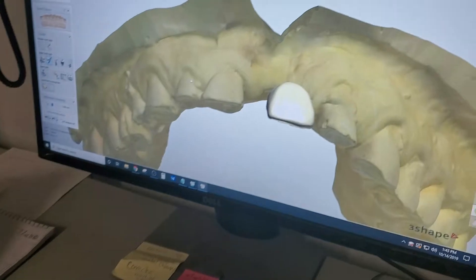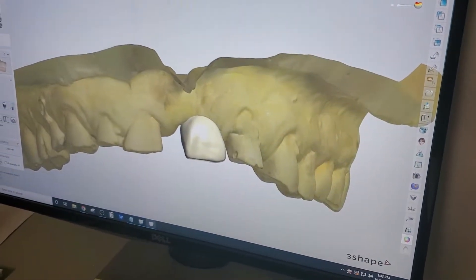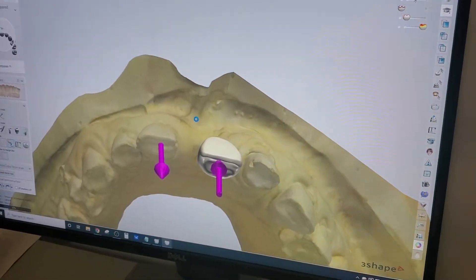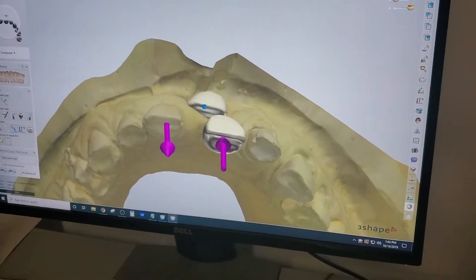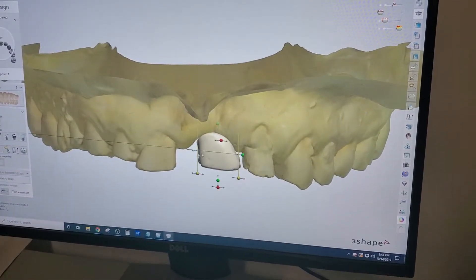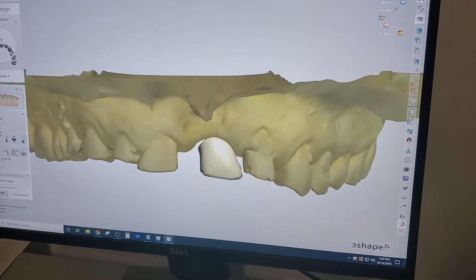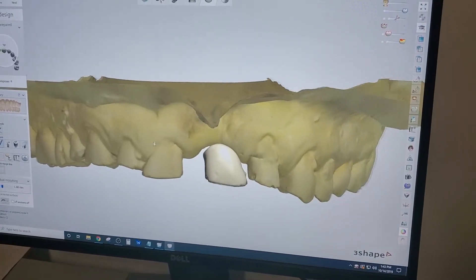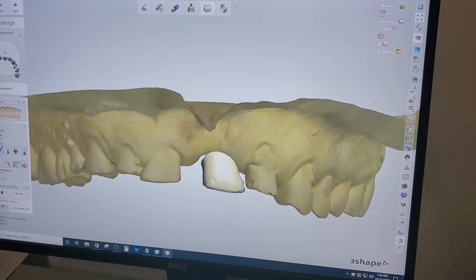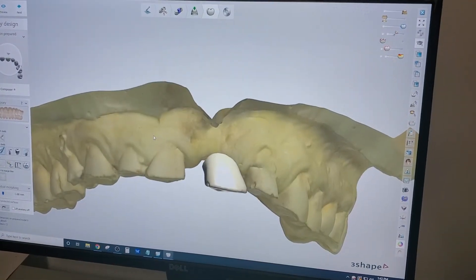We decided to scan this in, and then using the 3Shape mirroring feature, we're going to mirror tooth number eight. Then we're going to mill out a denture tooth that's an exact replica of number eight, and attach it to the flipper.